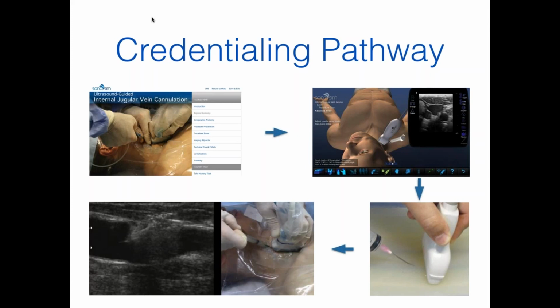They can then come to your sim center and, using a real ultrasound machine, and you can see here just a gel pad, they could practice cannulating either a vessel that you've created, or perhaps you're using some out-of-the-box manufactured gel pads. But again, they're still within the simulation space. And then they can move to the ICU or their clinical setting and place that line under the supervision of somebody who has been deemed qualified and has already been credentialed. Again, if any refresher training is needed, they can continue those steps once more.